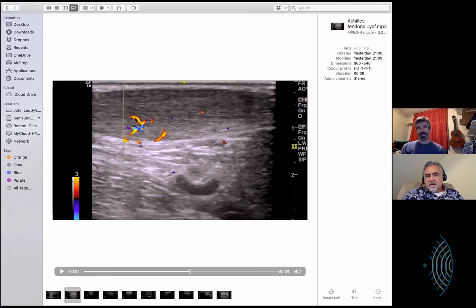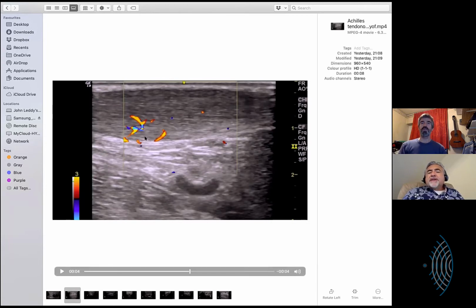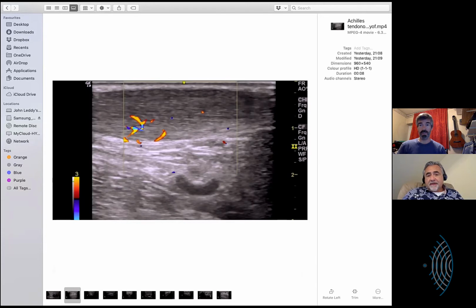You get this in tendons. You see it in tendons that are pathological. You don't see it generally in tendons that are not pathological. Now, that doesn't mean that they aren't there in tendons that aren't pathological, because there will be some vascularity, or at least there is some fluid moving in and out. Now that may not be as organized, not as obvious, and not on the scale that you're seeing when you see color flow. And that's the way I think of it.